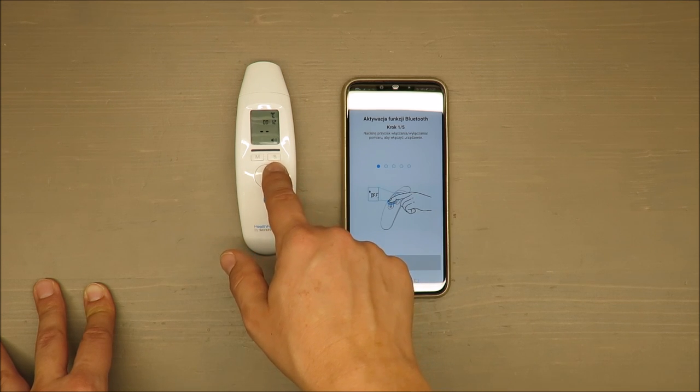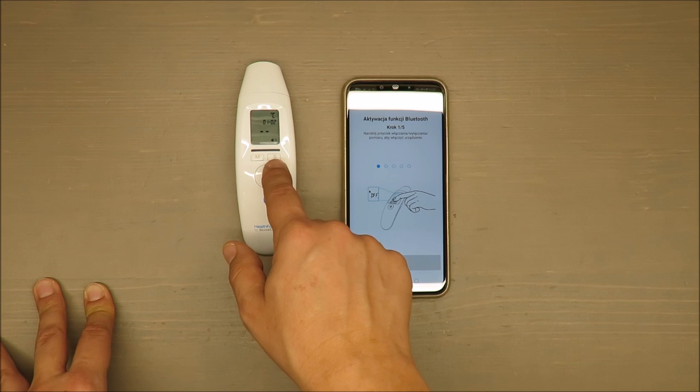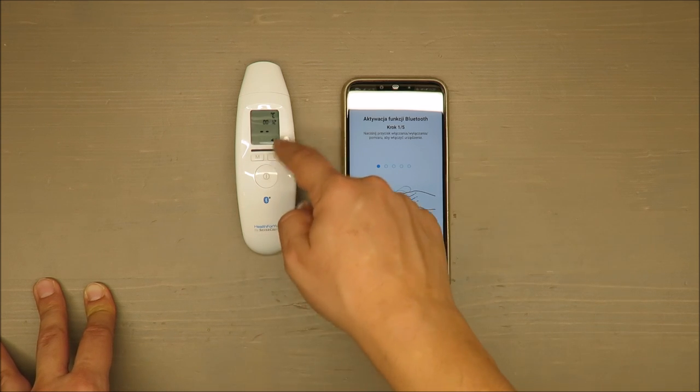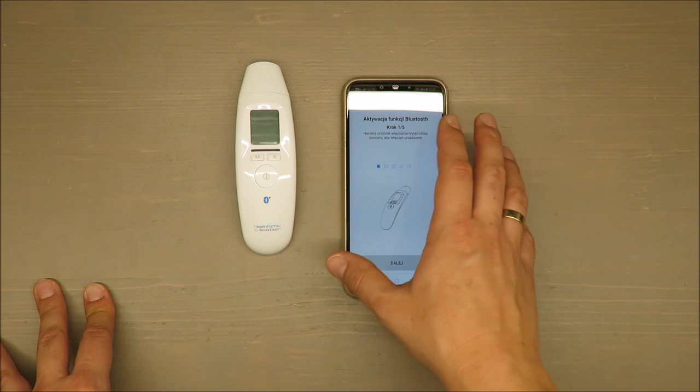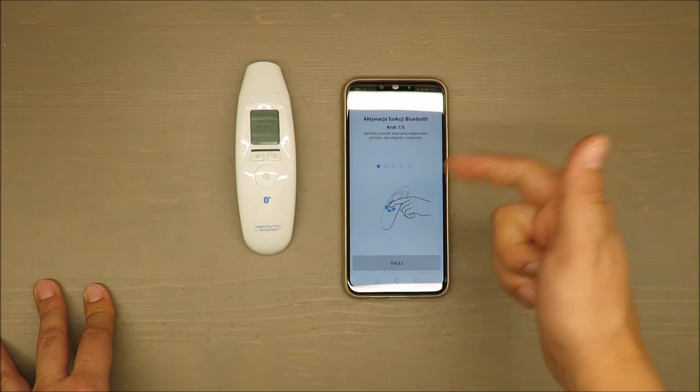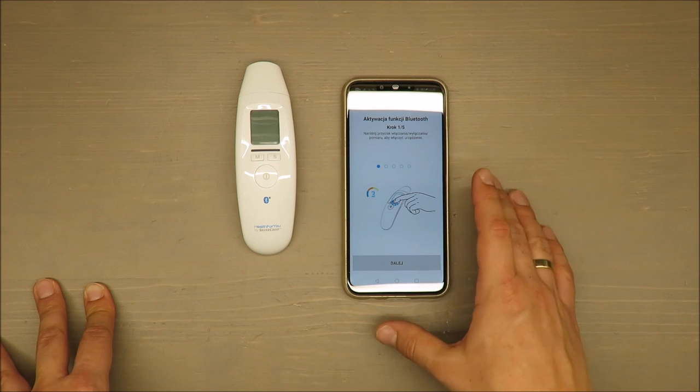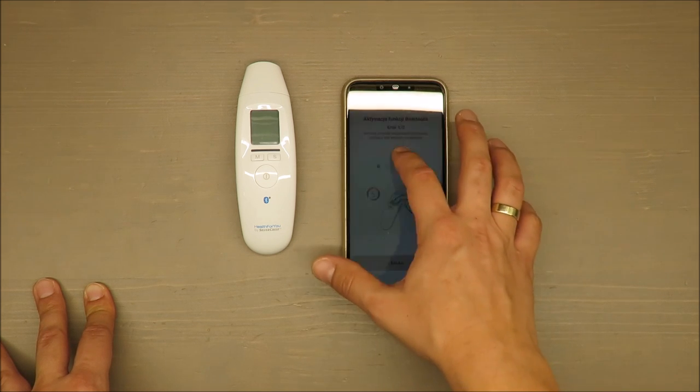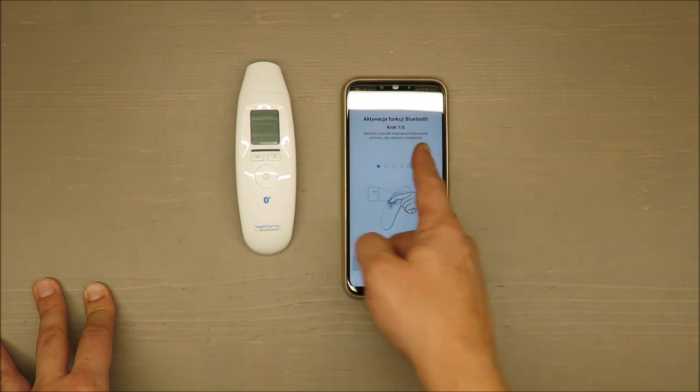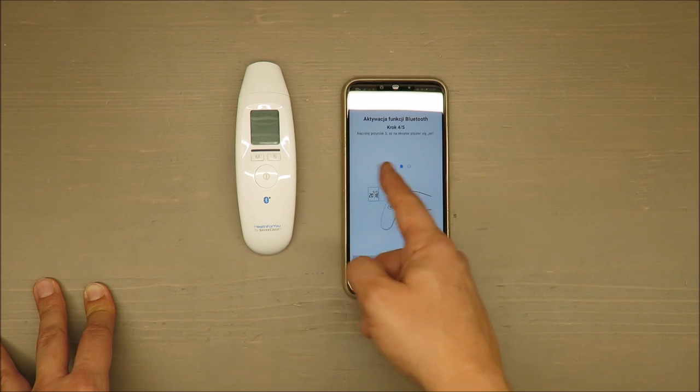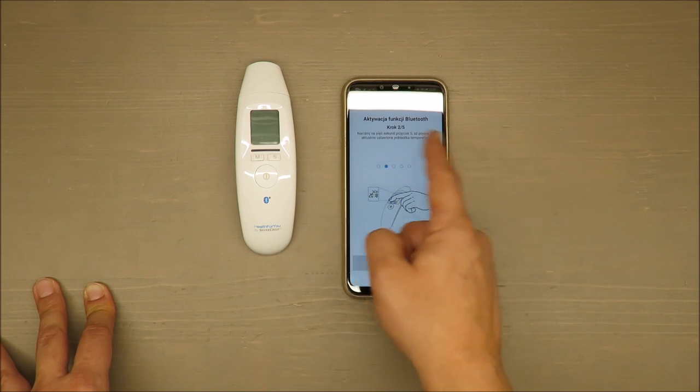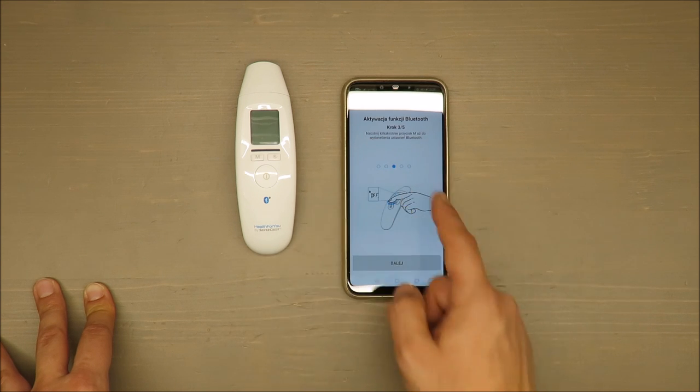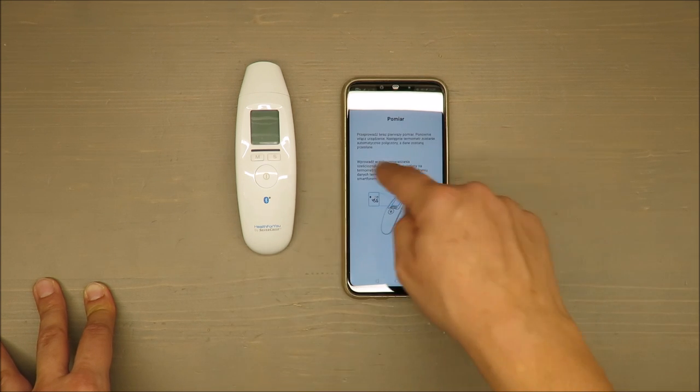In terms of basic settings, you should turn it on, then press for at least five seconds the button with the letter S. Then you will be able to go through the whole menu and set the date, Bluetooth on/off. You can do it in five steps.